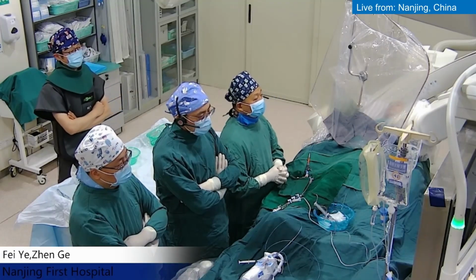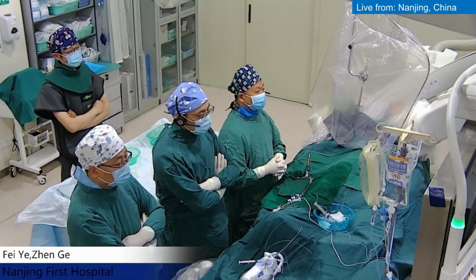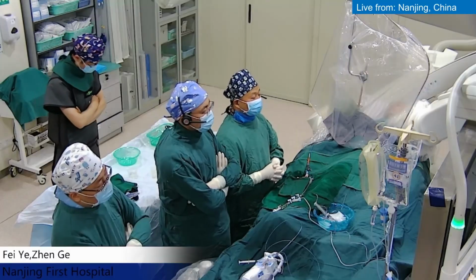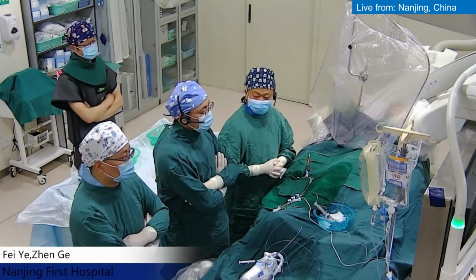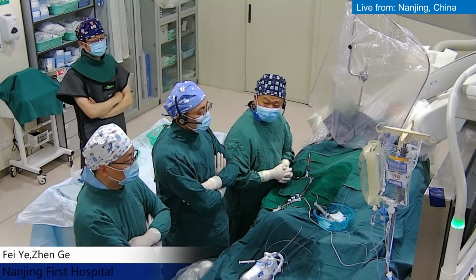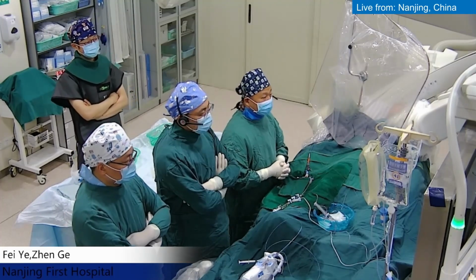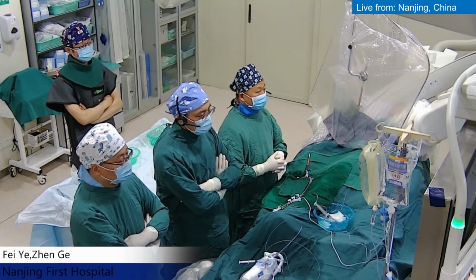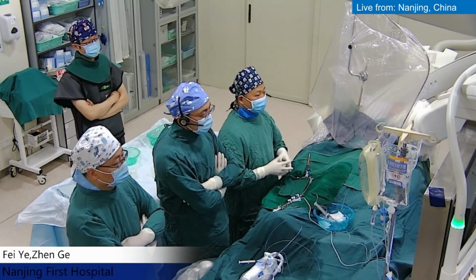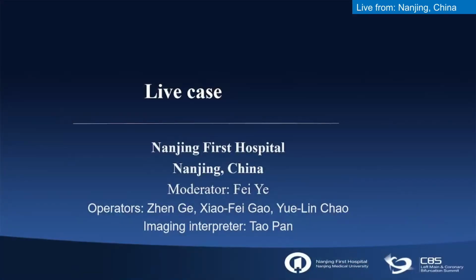Okay, thank you, Dr. Ye, for the introduction. Today we prepare the case for the distal left main trifurcation. First of all, I want to introduce our team. On our left, and on our right, are Dr. Gao and Dr. Chao, and our nurses and imaging technicians, Dr. Pan. I would like to ask Dr. Gao to introduce this case's clinical information. Please, Dr. Gao. Thank you. Please show me the slides.